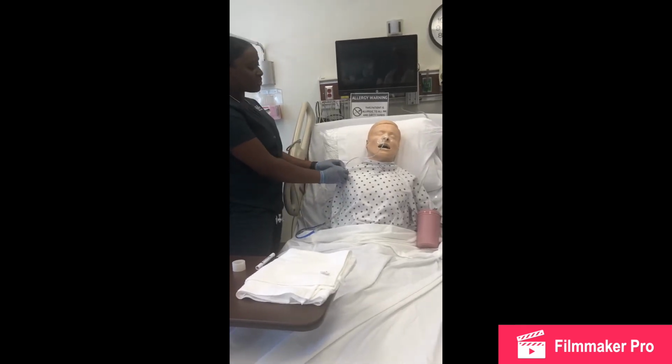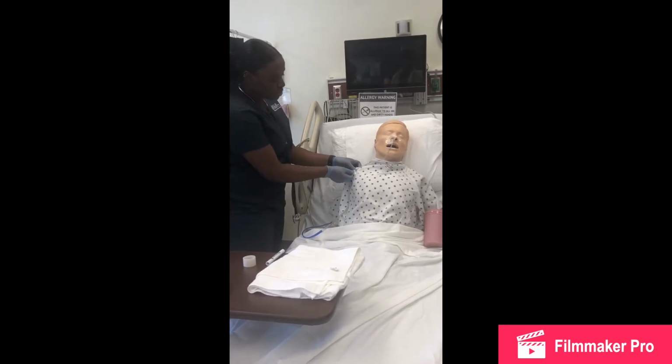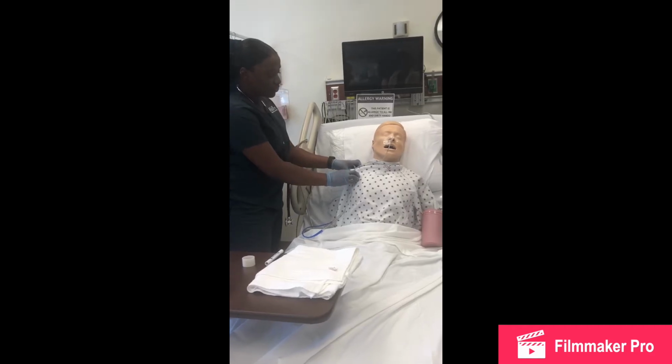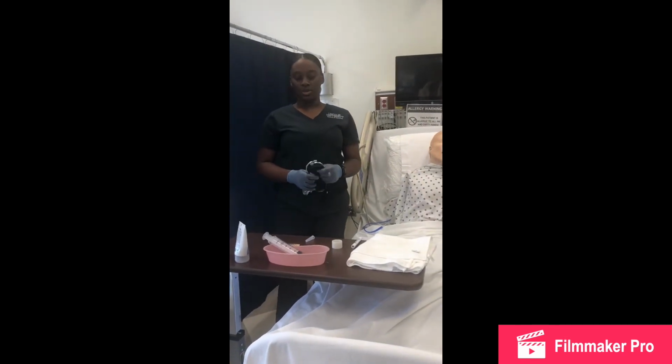Normally there will be a safety pin on the patient's gown, but in this setting we don't have one, so I would just use a tape to secure the tube on my patient's gown. So that is my video for inserting an NG tube.